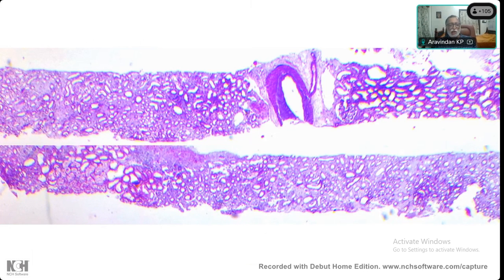Okay, so this is the renal biopsy. What's the comment? So it is a low power view showing two linear cores of renal tissue exhibiting mainly tubules, and a single glomerulus is noted. One single glomerulus is seen. The tubules have a separation of tubules. Very good. Indicating either fibrosis or edema. What would the separation be due to? So it could be either edema or fibrosis.